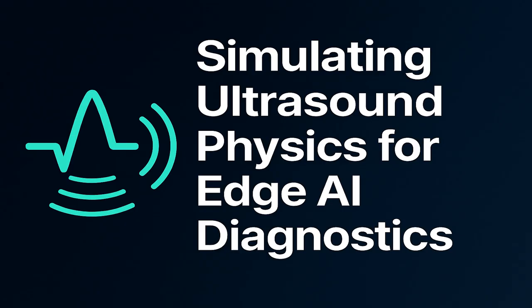You've got it. So that complex real-world process, sending a shaped pulse, having it travel, get attenuated, scatter, and then return, is just distilled into a series of simple multiplications in the frequency domain. It seems like the ultimate simplification of physical modeling. It really is. The total raw RF data spectrum, RF total, is simply the linear sum of all those thousands of individual scatter responses across all the transmit events and all the receive elements.